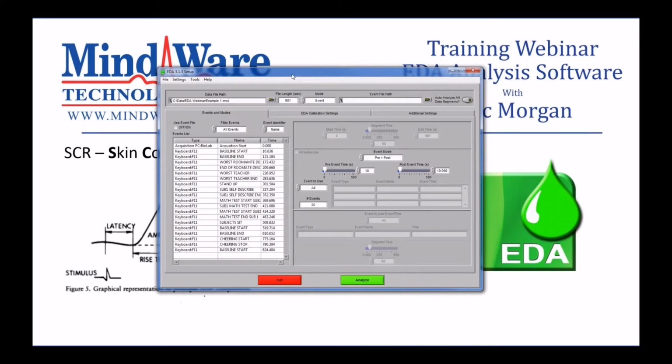So this first tab, Events and Modes, defines how we're going to segment our data. Now, this is a little more important in EDA than it is in some other applications because when we're looking at SCRs, the skin conductance responses, we want to see if they're directly related to an event or a stimuli that was presented to our subject during our experiment. And in order to do that, we have to be analyzing in event mode so that the application uses those events to segment our data and then look and see if those SCRs correlate to those events.